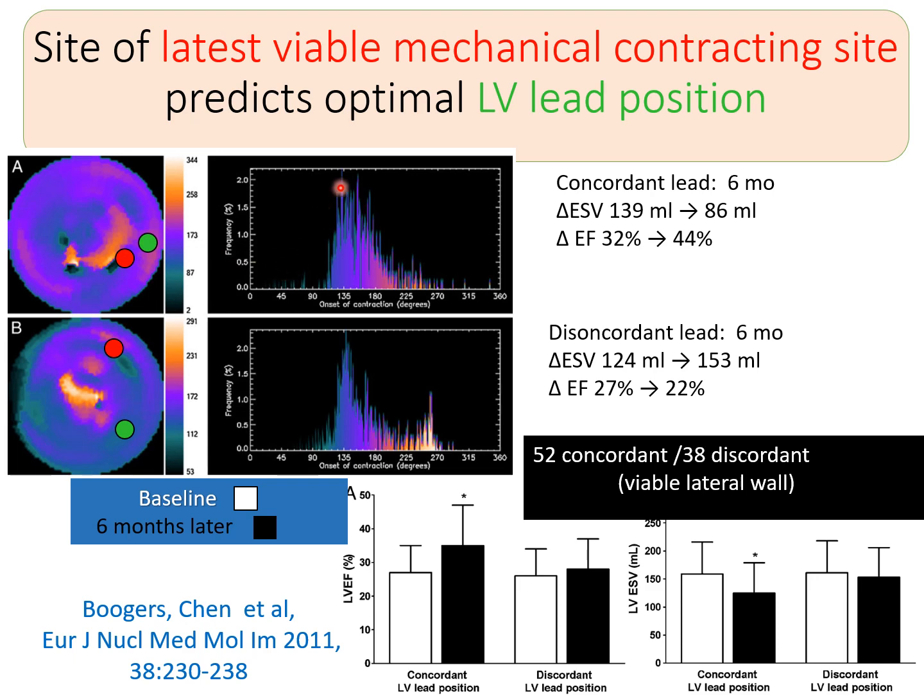This patient, and this is before therapy, in 6 months improved from an EF of 32 to an EF of 44%. Very significant improvement, and the improvement took place in terms of reverse remodeling. The ventricle actually got smaller. The end-systolic volume went from 139 to 86.